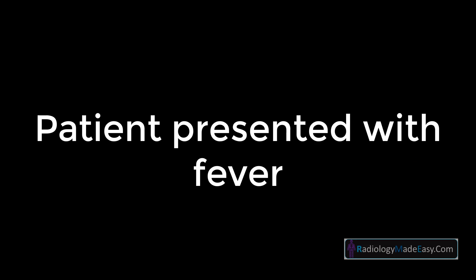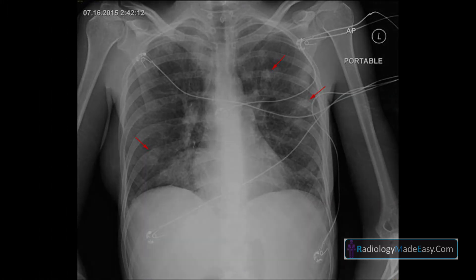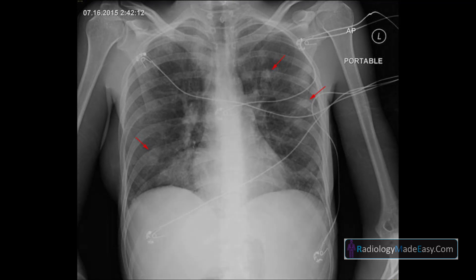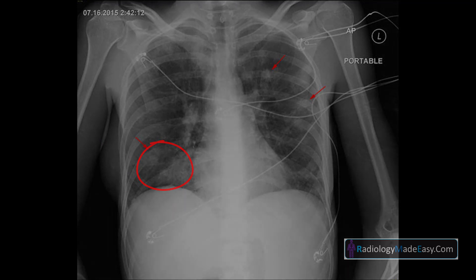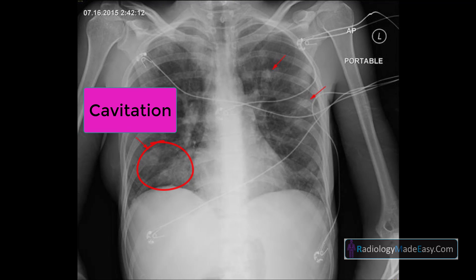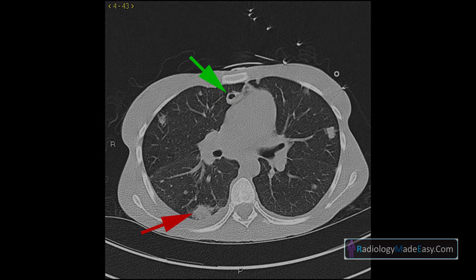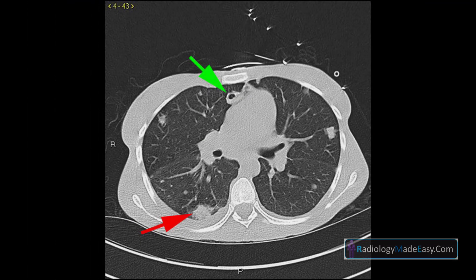This is a patient who presented with fever. Radiographs of the chest were obtained. A frontal radiograph of the chest demonstrates multiple bilateral peripheral nodular consolidations. One of the nodules in the right lung, indicated by the red arrow, demonstrates central lucency suggestive of cavitation.